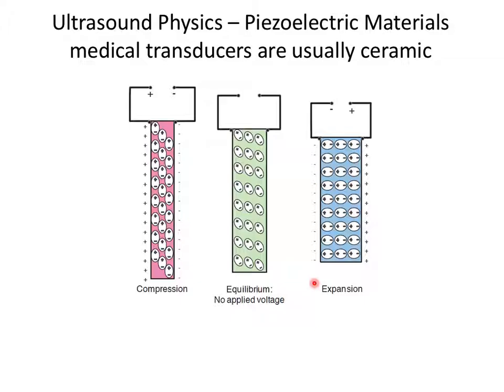As opposed to a large cone that has a coil on it and it's in a magnet, and that makes the cone vibrate. That's how normal speakers work, whereas these guys are just these flat piezoelectric crystals.